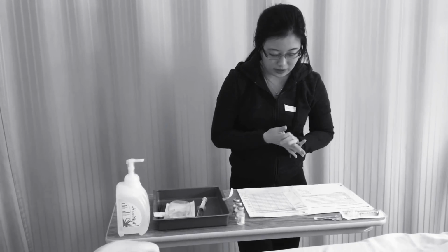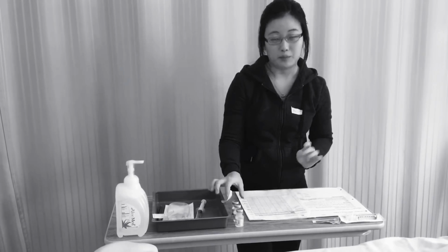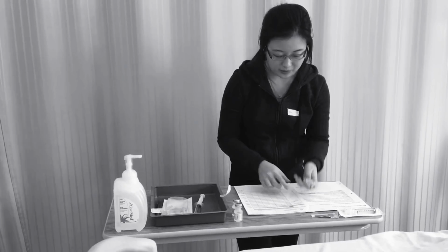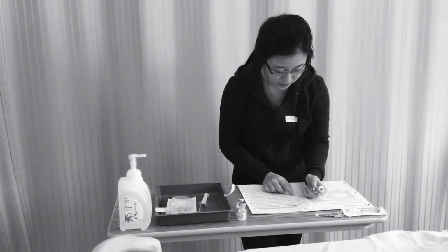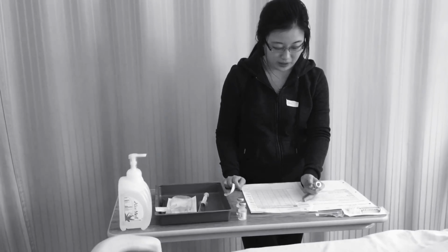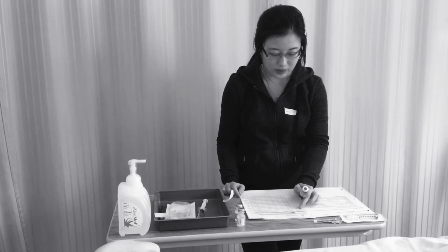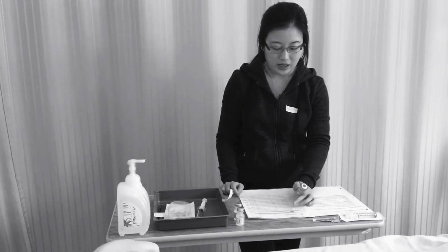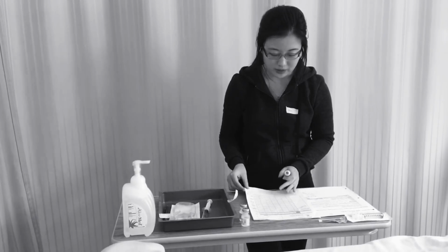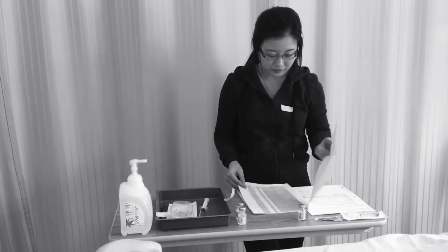Okay, so the drug that we need today is hydrocortisone. So I'll grab that from my Pyxis. So this is the drug. I'm going to compare it to my MAR. This is a 250 mg vial, but I only need 200 of it, and it'll be IV every 4 hours. Right now the time is 10, and the last time he got it was 6 a.m. this morning, so that was 4 hours ago. So that's all correct. Now I'm going to check my monograph.